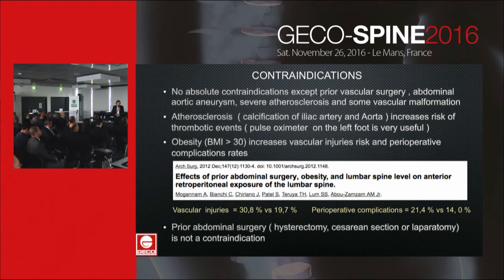Atherosclerosis increases the risk of thrombotic events. In this case, it is necessary to be careful with the retractor, and a pulse oximeter on the left foot is very useful.